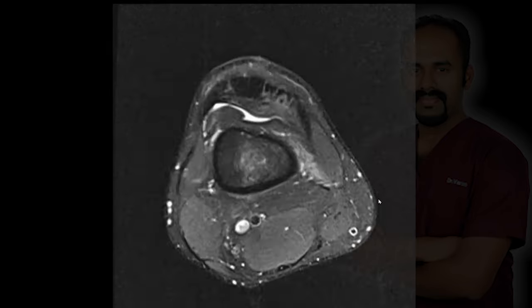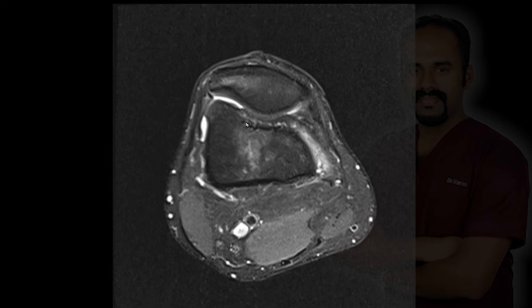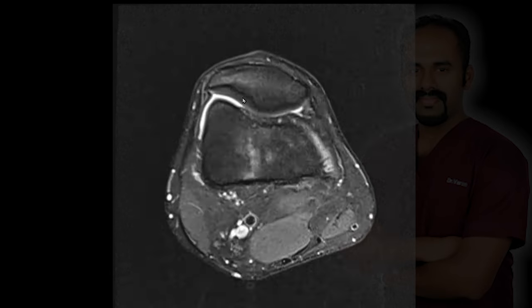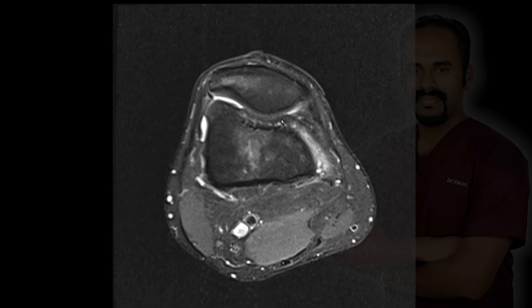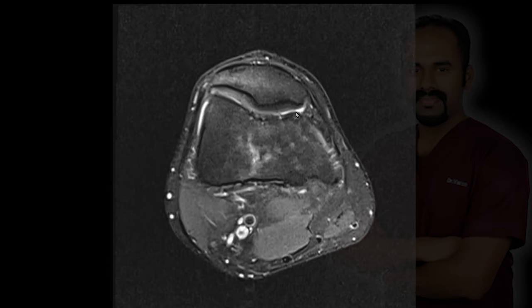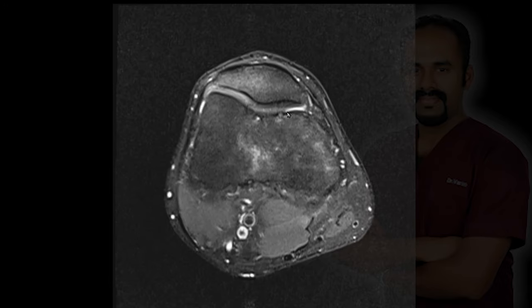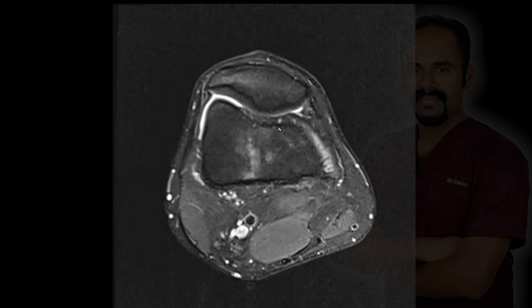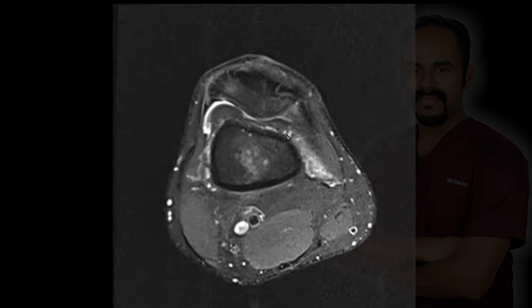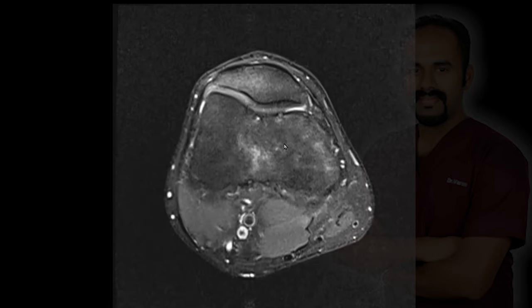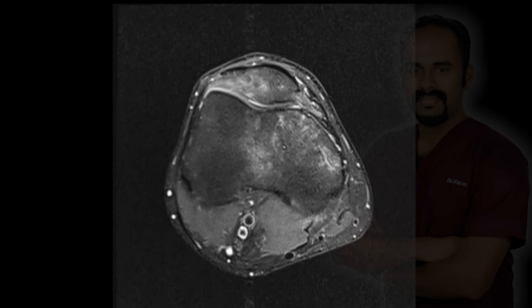Let's have a look at the patellofemoral joint on the axial PD fat-saturated images. The articular margins of the patellofemoral joint also look fairly preserved. So this is a case of partial thickness ACL tear with mild effusion and contusion of the distal femur.